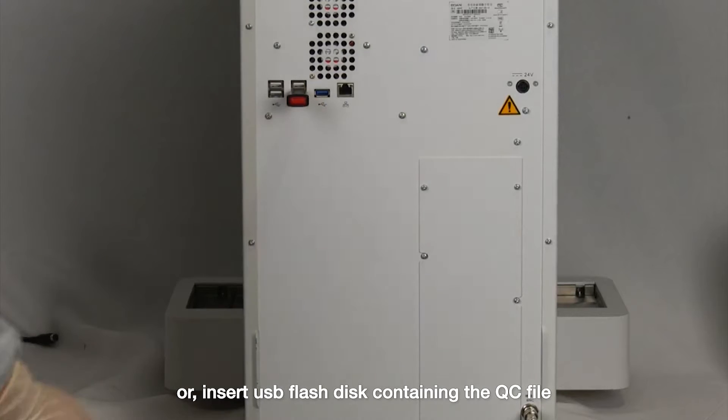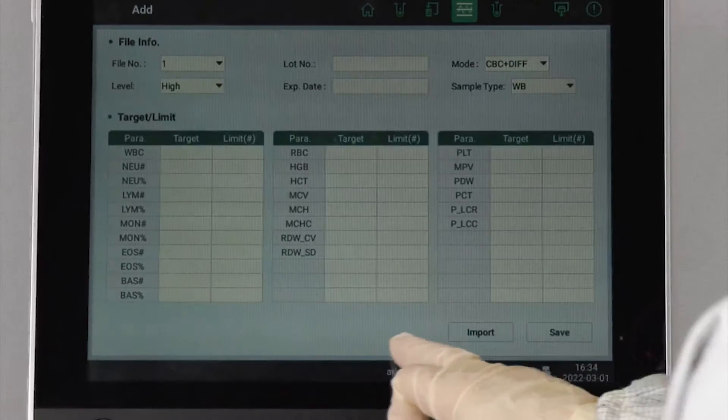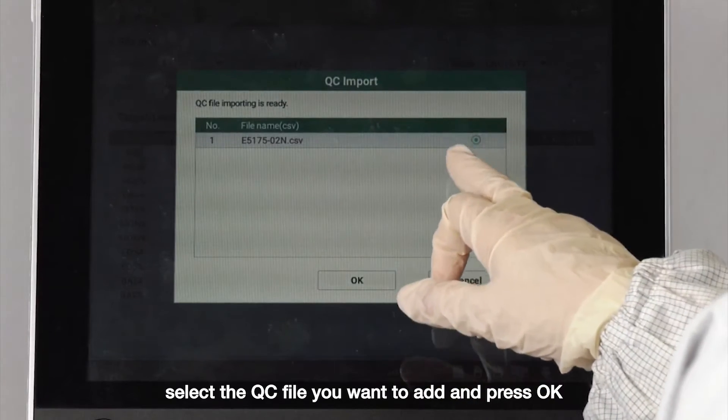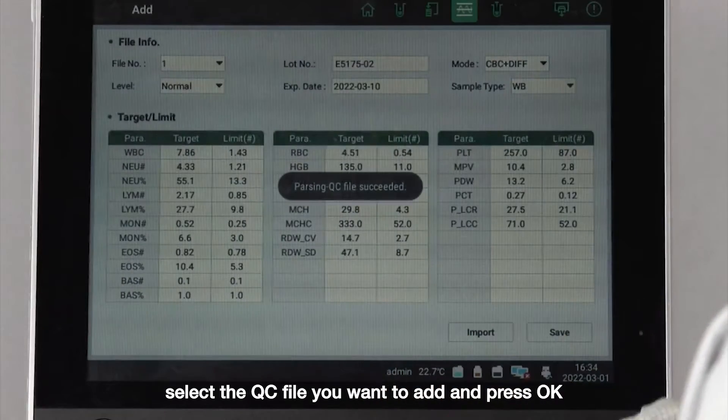Or, insert USB flash disk containing the quality control file under specified directory. Press import button, select the quality control file you want to add and press OK.